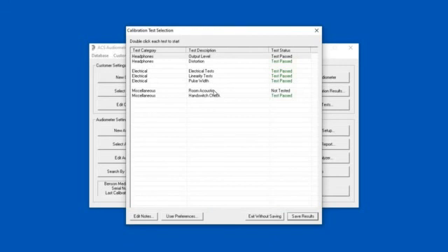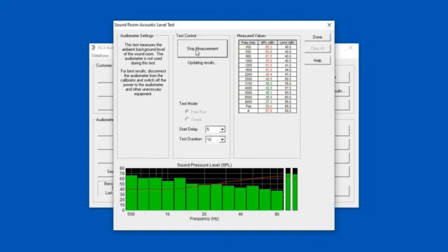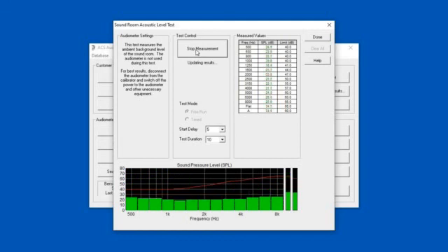We've done everything except room acoustics. I can simply do that by taking the microphone out of the coupler and placing it in the sound room. I'm in a pretty quiet environment, so we might be able to get by with it. This red line here indicates the OSHA criteria for the allowable background noise levels. I'll simply start the test — and there are the background noise levels, and that's me talking.